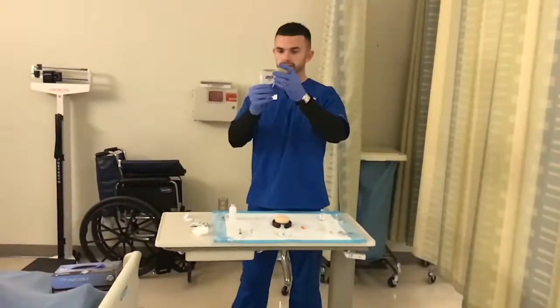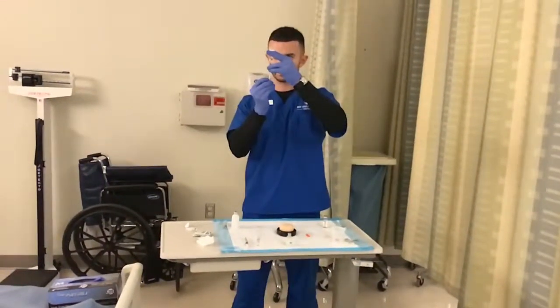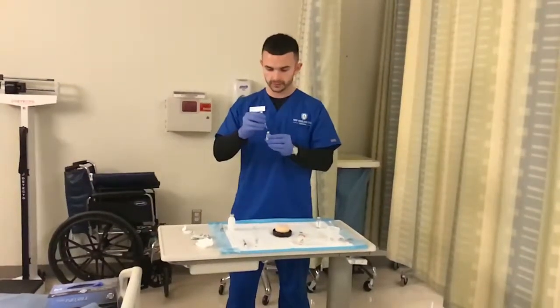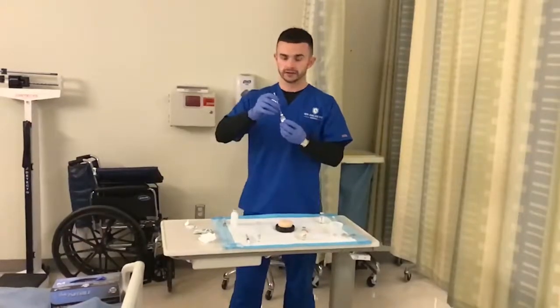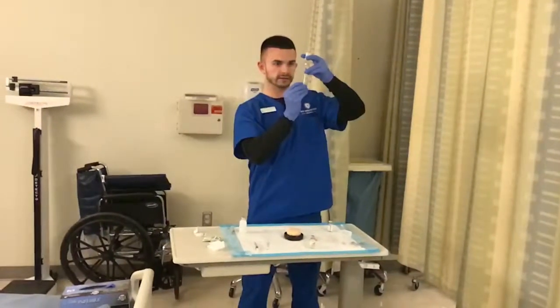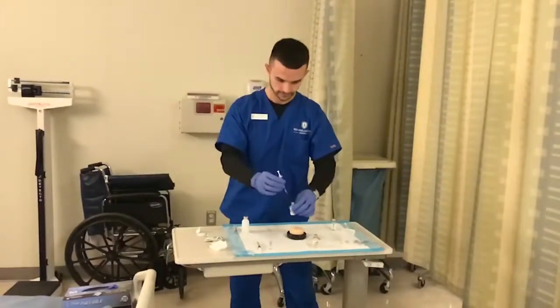Then from there, I'm going to go ahead, flip my vial, and I'm going to pull back my 5 units. Now, when doing the NPH, you want to be real careful to pull back the correct amount of medication, because unlike the other injections, you cannot mix the meds because they're already mixed, so you can't put the medication back in to get it at an equal level. So I'm going to draw up my 5 more units of NPH. Again, if you see any bubbles, you can flick it to get them out.